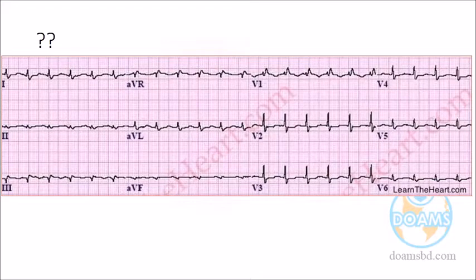So rather, the things are different. Can you identify any lead having the voltage more than 10 in the chest leads? That means V1 up to V6. Yeah, yes, in V2 and V3. V2, V3, is it more than 10? No, doctor. Can anyone help, our 5 participants? Is there any more than 10? Do you agree? No, no, no. Not more than 10. Not more than 10. 5. Yeah, 6, and in V7, maybe 8.